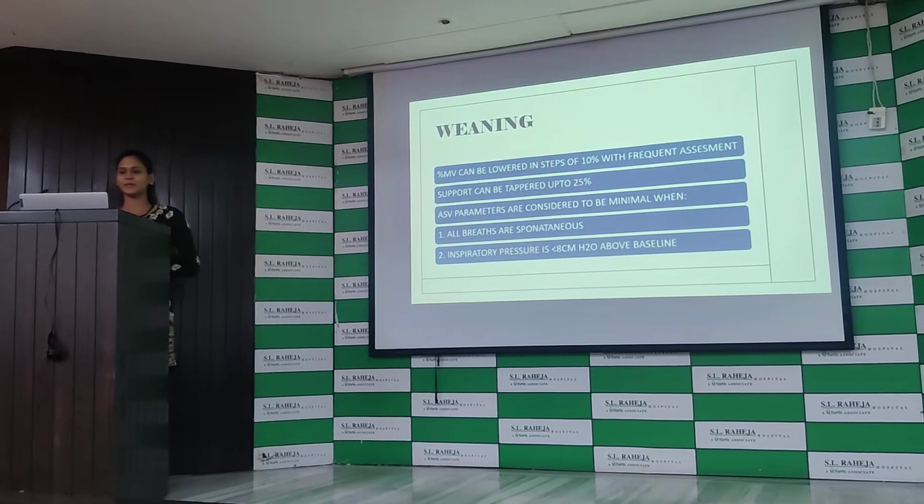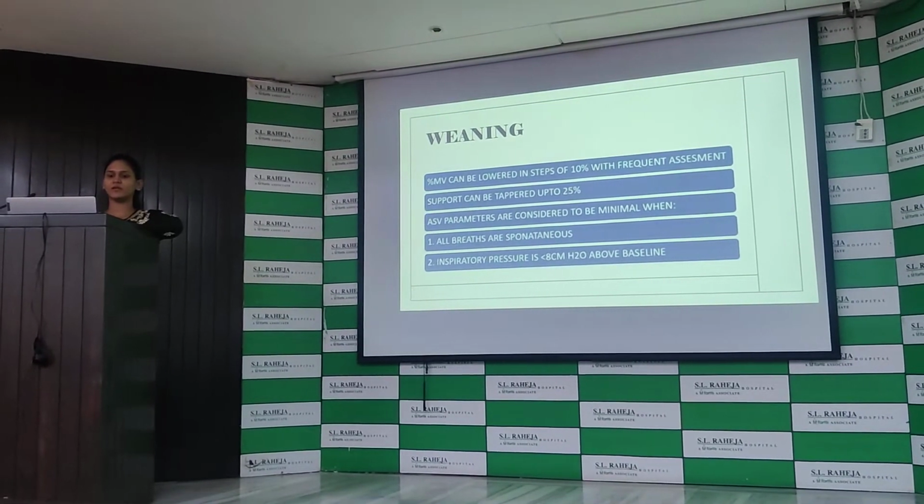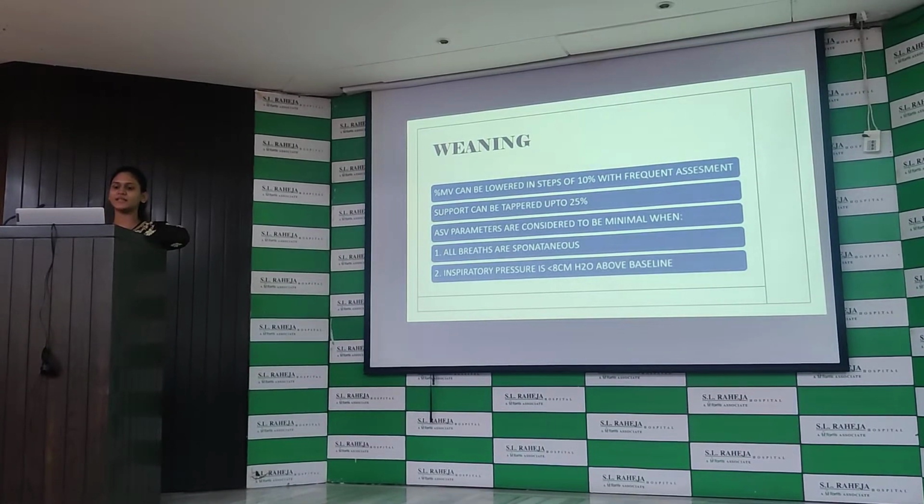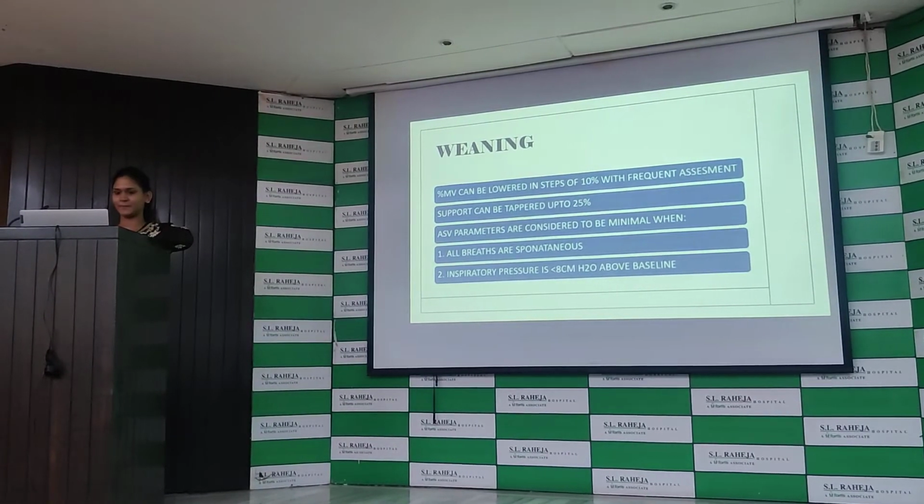Now the ASV parameters are considered to be minimal when all breaths are spontaneous and the inspiratory pressure is less than 8 cm above the baseline.